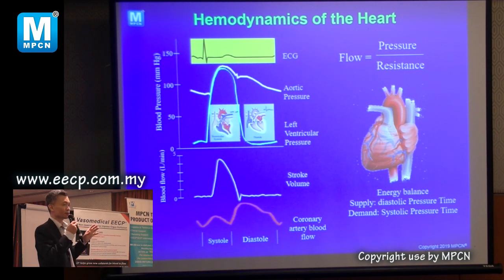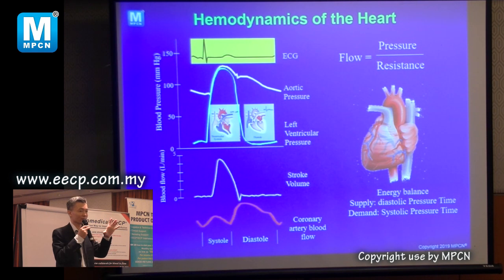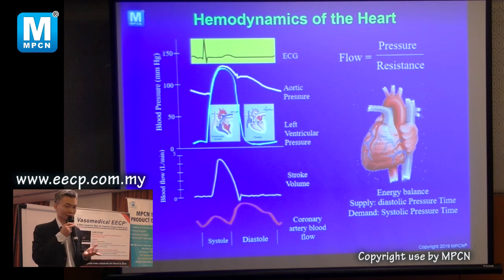But another condition that you have to be aware of, when the pulse pressure is so high, pulse pressure meaning that systolic and diastolic are very far apart, more than 60, 80, is aortic leakage, a leaking valve. So if you have this patient, then maybe it is contraindicated because the pressure difference is so big, maybe the valve is leaking. It's a sign that something is wrong.